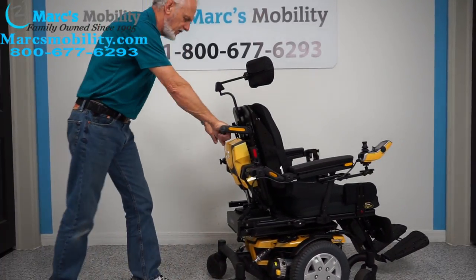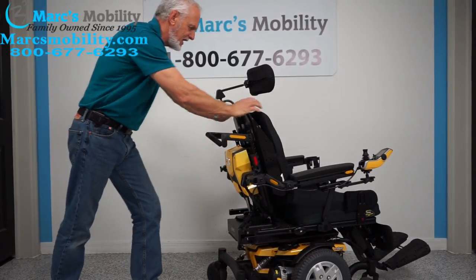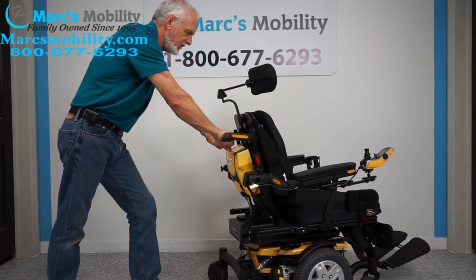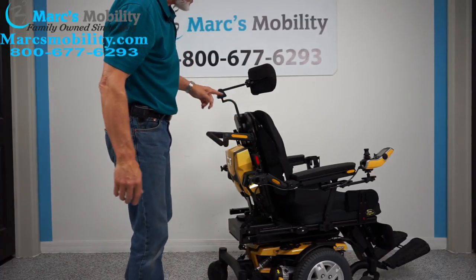Also with this chair, we have push bars here. So if you had this chair in neutral — it is a heavy chair — it's nice to have push bars instead of having to push on the seat. You have push bars here and you can push this chair around manually. The headrest is fully adjustable.